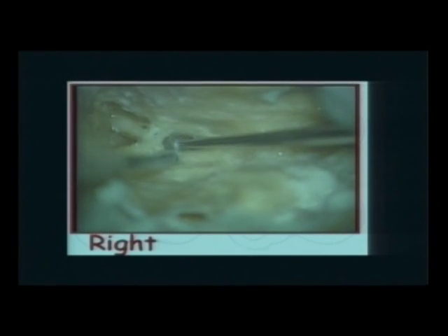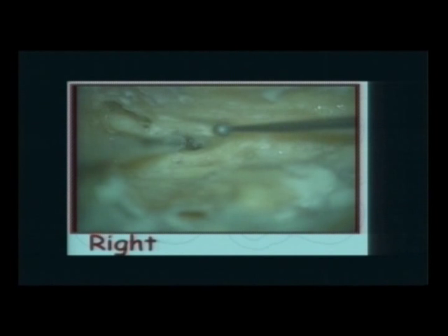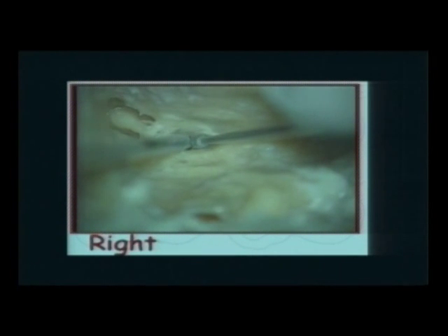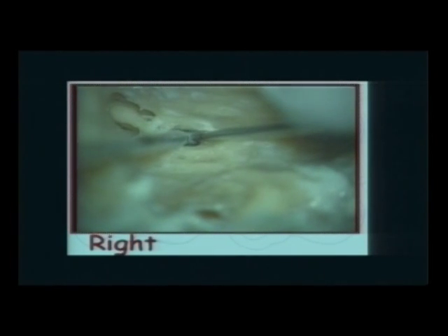So always keep your eye where the incus points. That's why always keep the incus in position. Because when you drill this bone out there, some of you hit the incus, and it changes its direction. And so you're lost. The incus is the most important landmark.